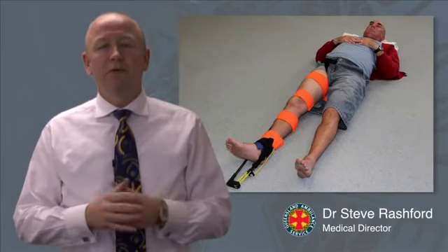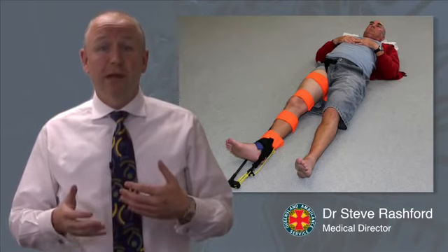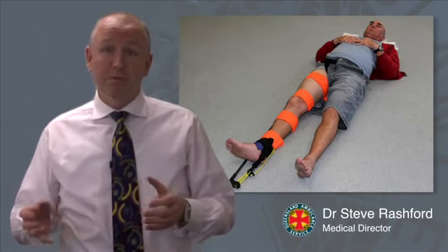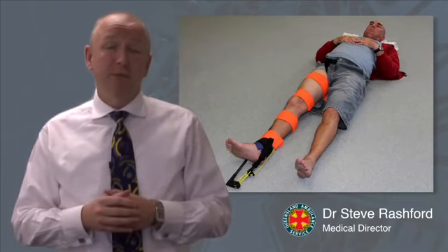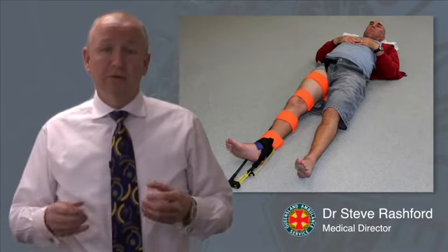By now you will have read the Lassen Directive on the CT6 splint and committed it to memory. From here, you're watching this video which will demonstrate the application of the splint. The next thing to do with a work colleague is to apply a splint to each other and get to know the workings of the splint so that you can adequately perform it in an operational environment. Then go to LMS and complete the self-sign-off. From there, you're free to use the CT6, and it will be a very important part of your patient care.